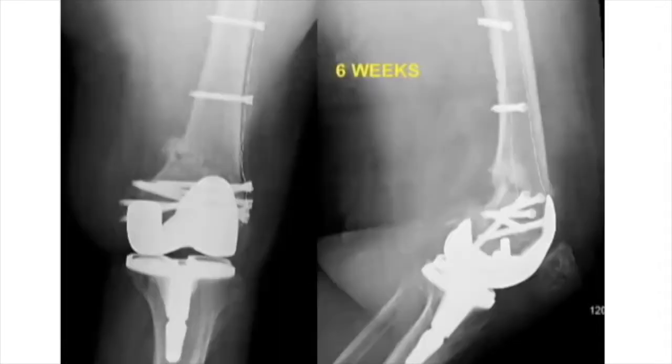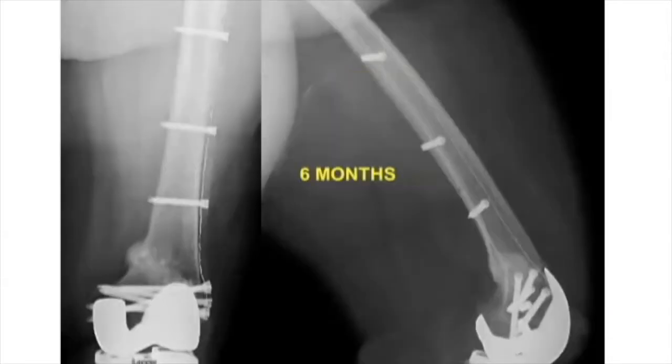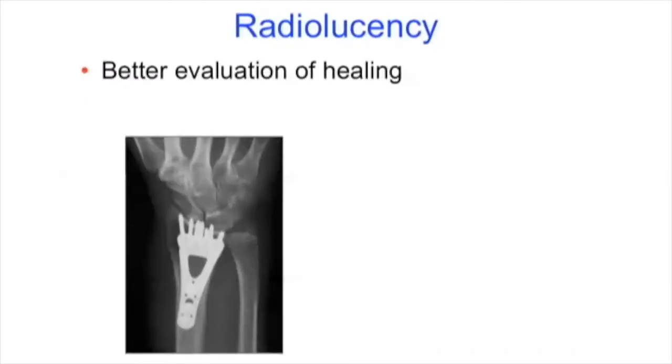Now, going back to the 6 weeks, most of us, if we did a periprosthetic fracture in this patient, we probably would restrict the weight bearing because we're concerned about her healing potential. Because she was already demonstrating excellent callus formation in 6 weeks, I let her start weight bearing immediately, because I felt strong enough in the construct based upon the literature and based upon what I was seeing with her clinically. In the 6 months, she's actually walking very, very well. And so there's an argument to be had with utilizing this implant to help expedite the healing potential early on to initiate earlier weight bearing.